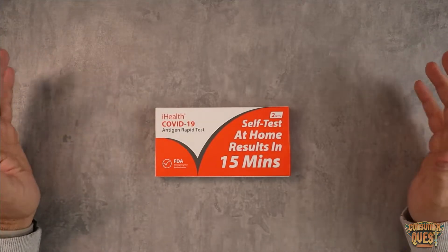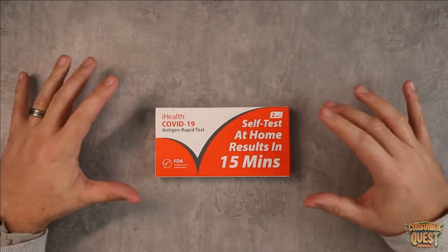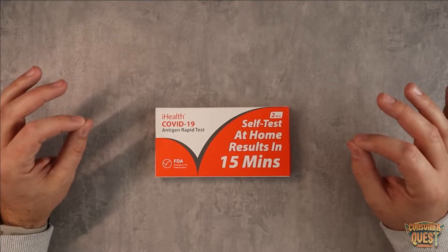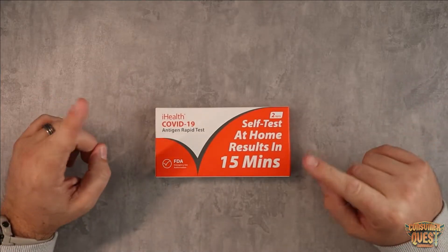What is going on guys? Today I wanted to show you very easily the step-by-step process to take the iHealth COVID-19 rapid antigen test. This thing is super simple. I've used a few different tests in the past and this one is by far the easiest. So let me open it up and show you what you get and then how you do it.